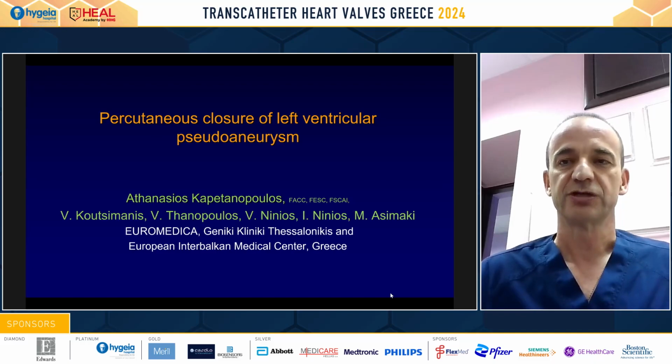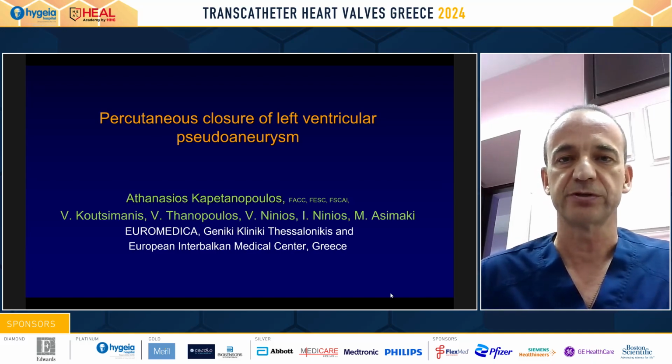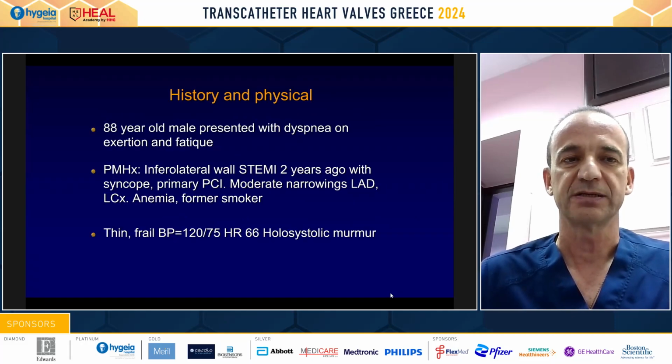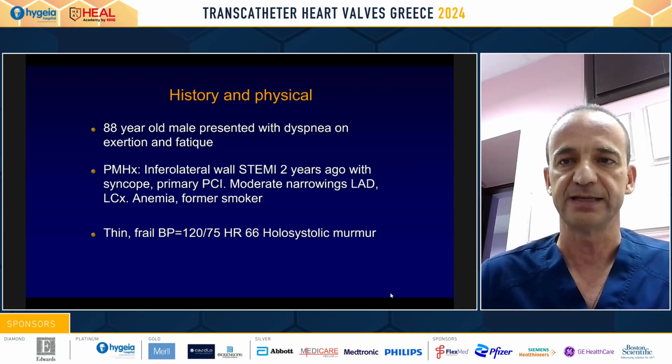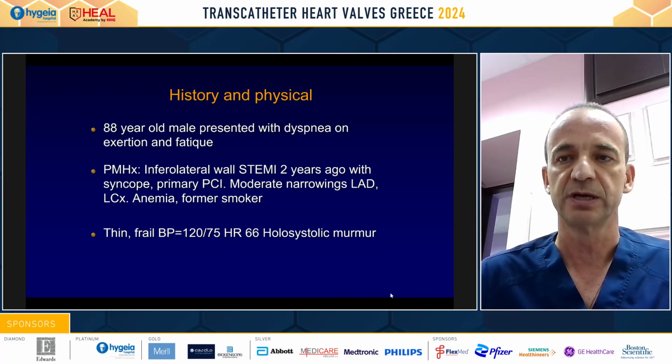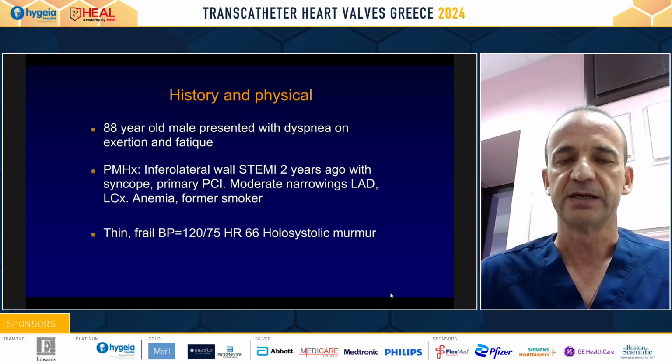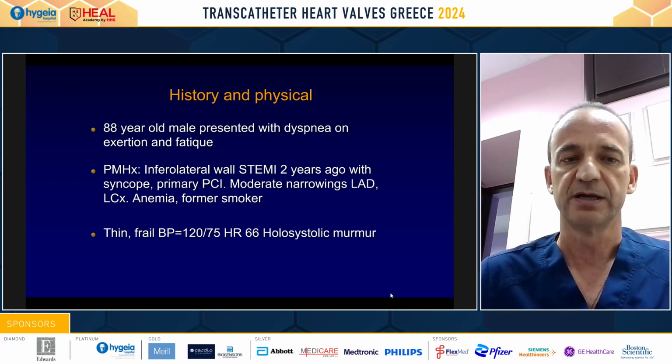Okay. So I'm going to present a case of percutaneous closure of a left ventricular pseudoaneurysm. Our patient is an 88-year-old male who presented with dyspnea on exertion and fatigue. He had a past medical history of inferolateral wall ST elevation MI 2 years prior to presentation, which was complicated with syncope and was treated with primary PCI of the right coronary artery. At the same time, he had moderate narrowings in the LAD and the circumflex arteries. He had chronic anemia and he was a former smoker.